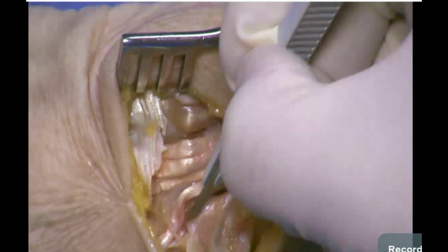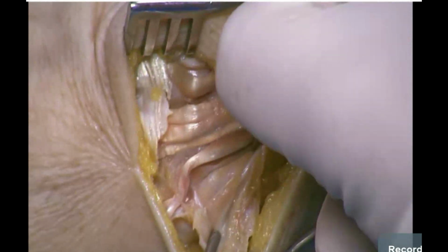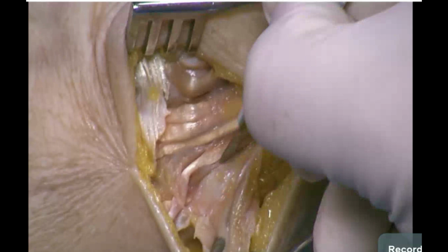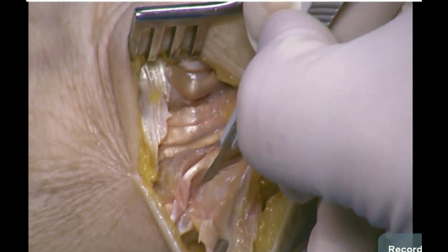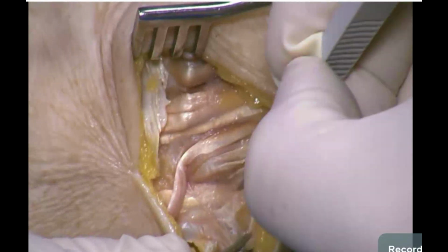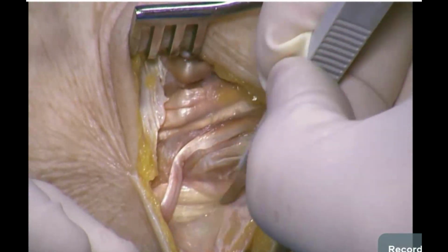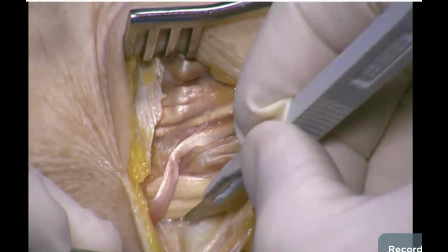And once the EPL is exposed, that gives us access to Lister's tubercle. And then we want to stay as subperiosteal as you can. The retinaculum can thin out in this region, especially proximally. So taking some of this periosteum between the third and the second compartments is often useful. There's our periosteum and the second compartment. Just a little more off the second compartment.